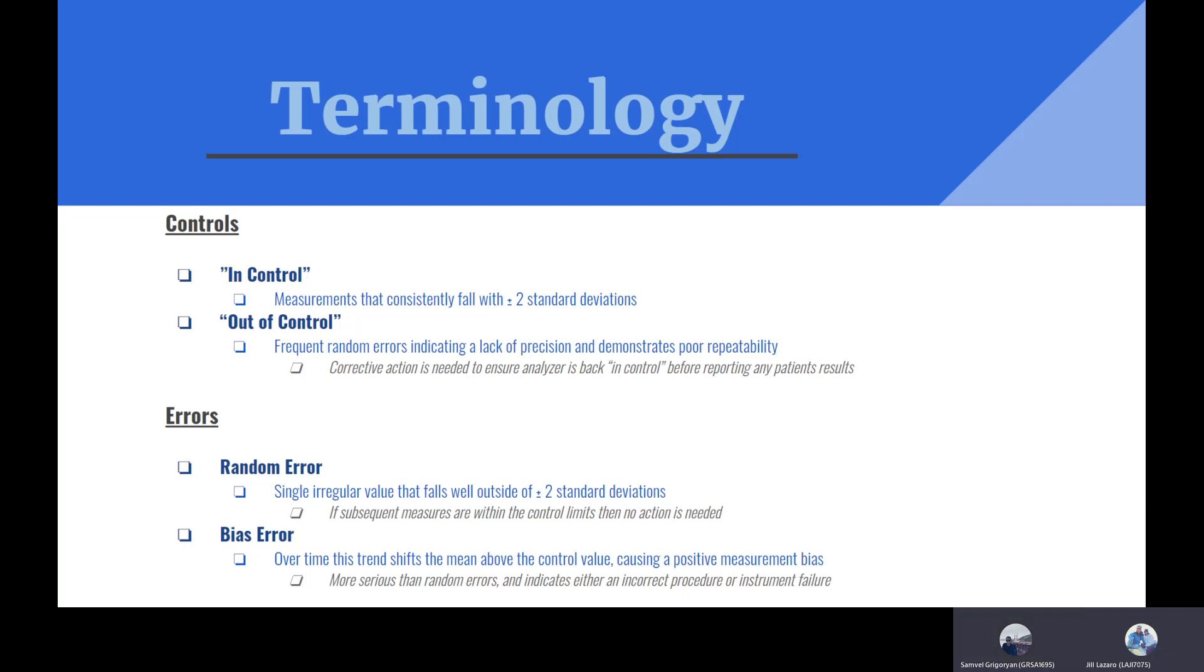We can have out of control, which is frequent random error that indicates a lack of precision and demonstrates poor repeatability. This is important because if we see an out of control state, we need to take corrective action to make sure that our analyzer is back in control. We're realigning it, making sure that it is where it's supposed to be.